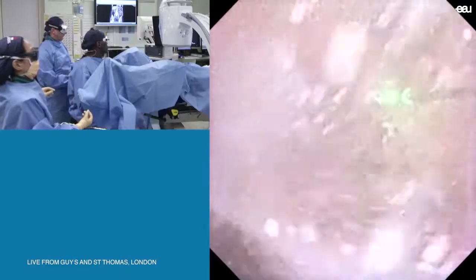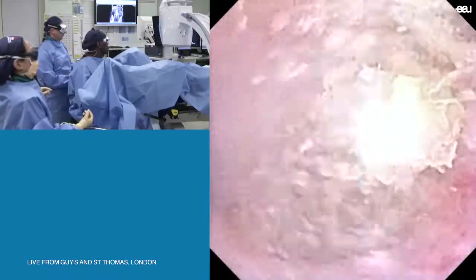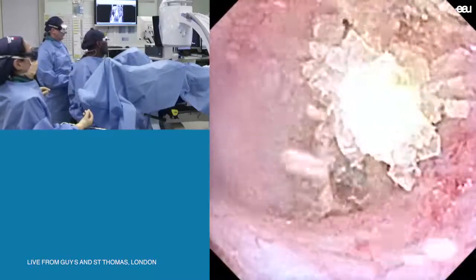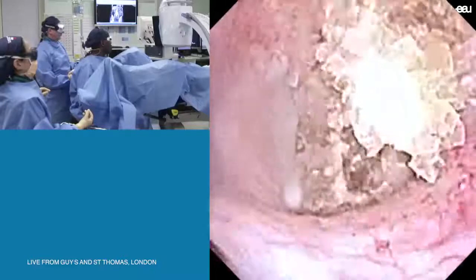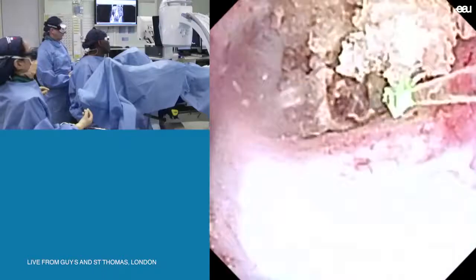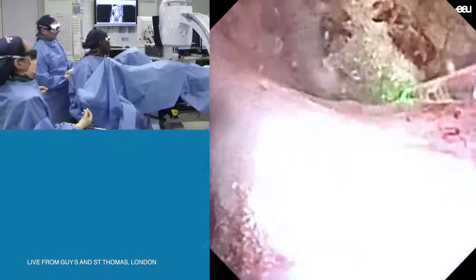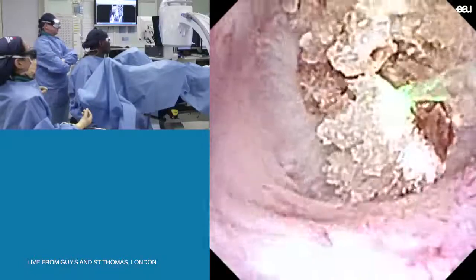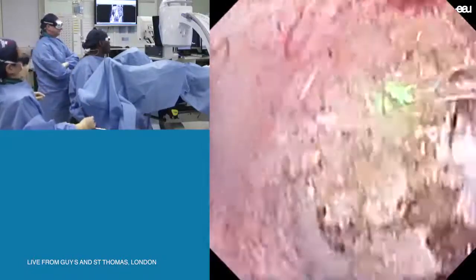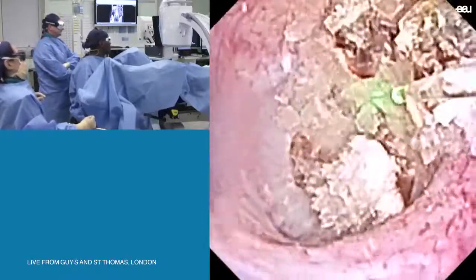You're working nicely into this stone. Could you have any comments on the stone composition? What do you think it is? It's interesting — when you first look at it, it looks like a calcium oxalate dihydrate stone: nice crystals, nice and soft. But with a Hounsfield unit of 1,200, when you look through the core of it, it could be a monohydrate stone — it's a little harder. You can see it's a combination, I think, of both monohydrate and dihydrate.